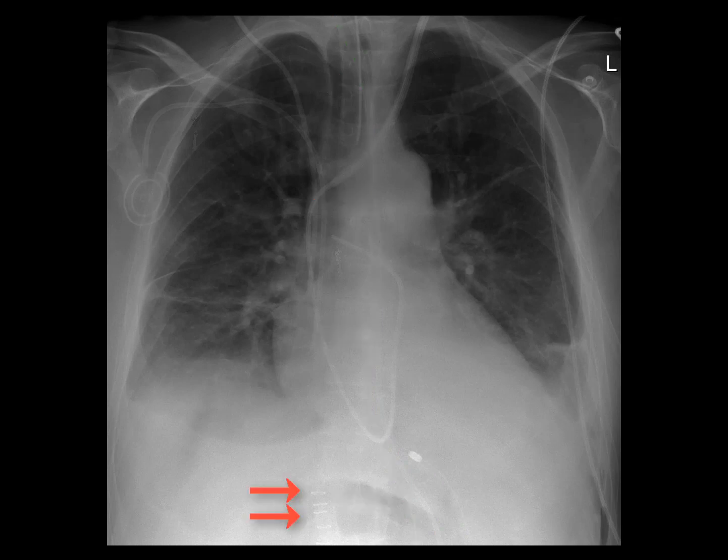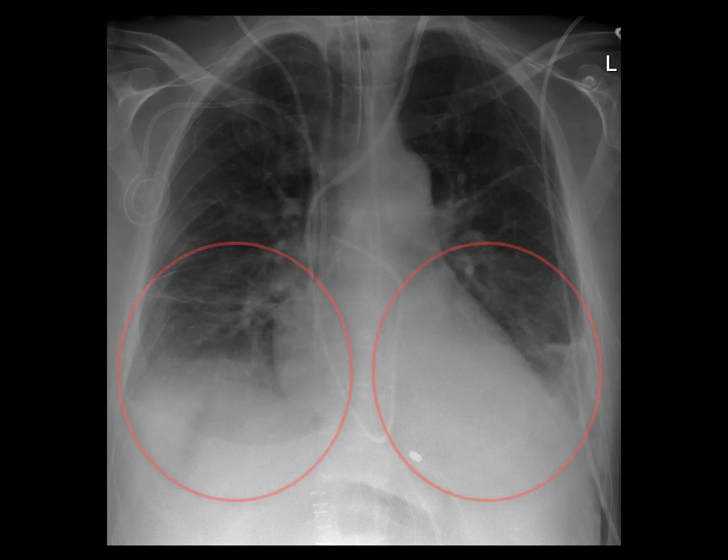You'll also see some skin staples from a recent abdominal surgery, small bilateral pleural effusions, and left greater than right basilar airspace opacities. Feel free to pause the video and see if you can see all of these devices with the highlighting removed.